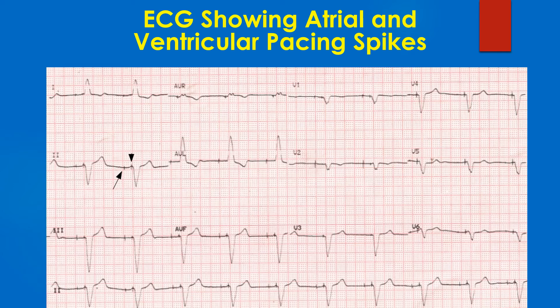Regular ventricular capture is seen after each ventricular spike. The paced QRS complexes are wide and have a left bundle branch block pattern with left axis deviation.